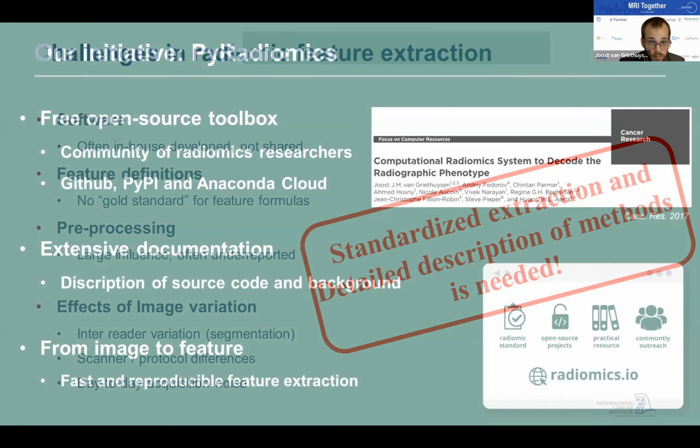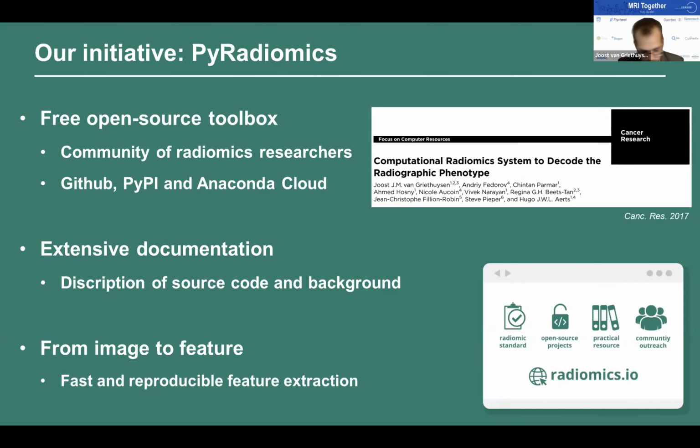So our initiative here was PyRadiomics, and our thought was, well, we can try and describe what people should do, or we can try and build something people can use so they don't have to reinvent the wheel themselves. And this led us to the development of PyRadiomics, which is an open source toolbox, free to use, with the only added benefit that you have to cite the work that we did. And we aim to generate a community of radiomics researchers that could share ideas and work with the same software to make the research they publish more comparable, leading to better and newer insights.